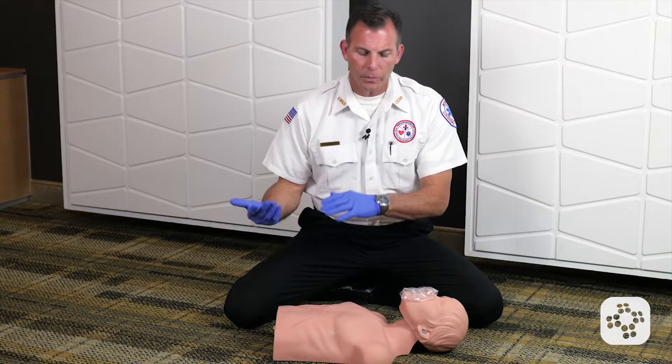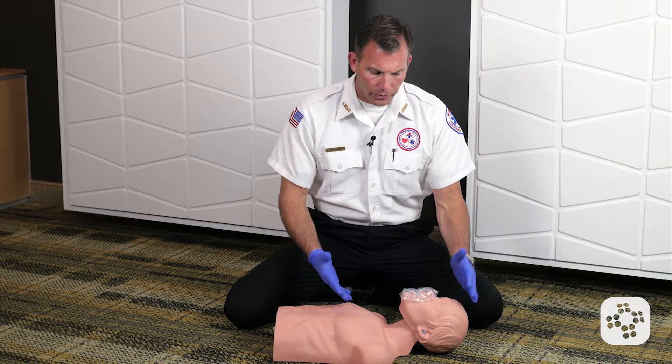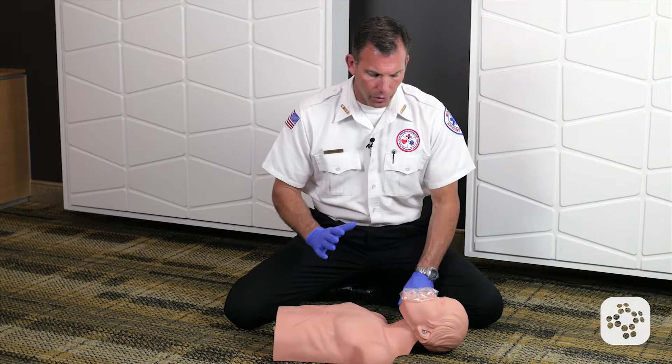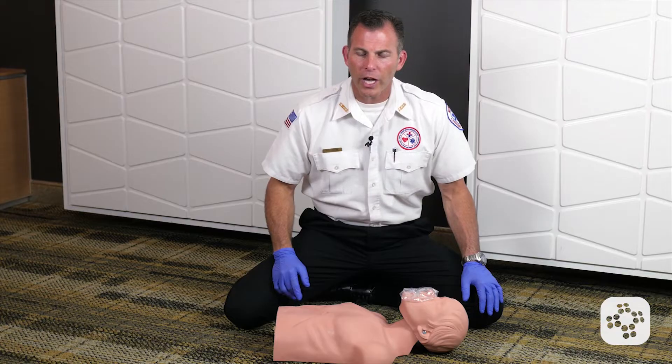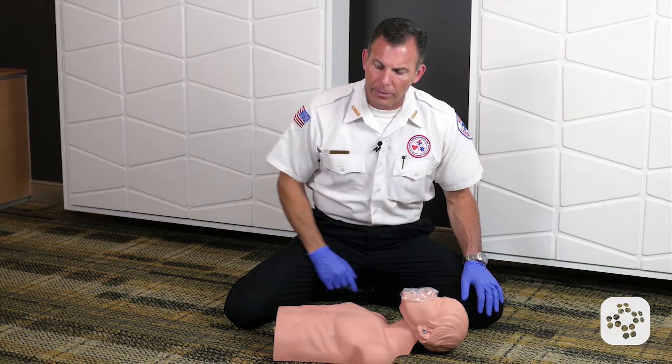My once conscious choking victim has now gone unresponsive. I carefully laid them down on the ground — they're now safely on the ground. I put on my gloves and have my CPR shield with the one-way valve. If I've not called 911 or called a code yet, I will have done so now. You in the plaid shirt, go call 911 and come back — I might need your help.